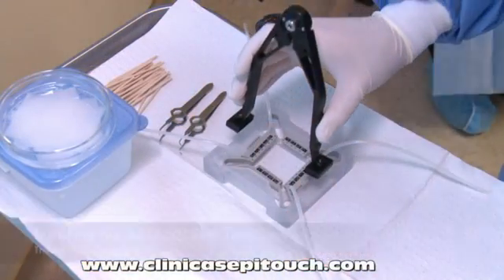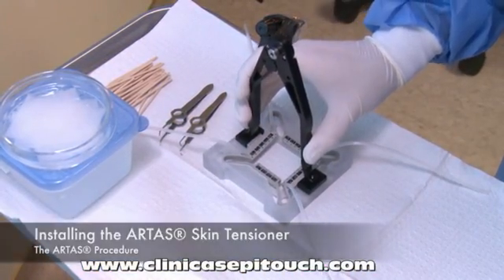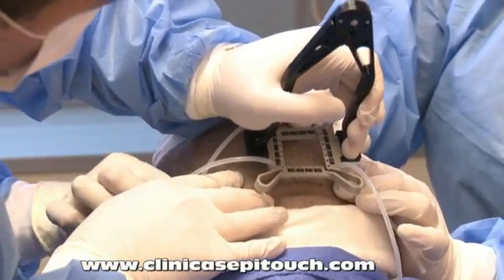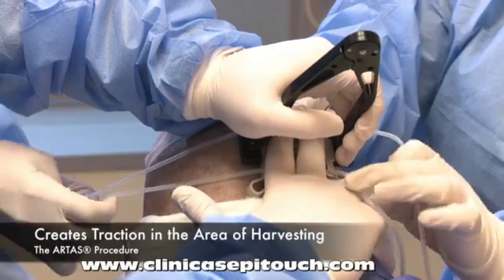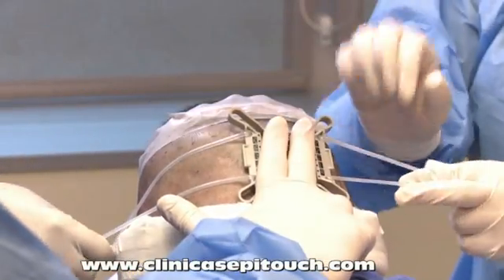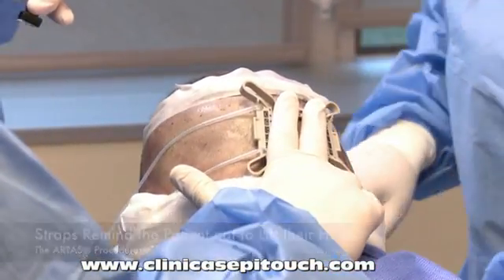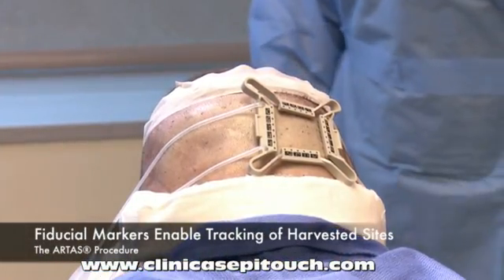With the patient seated comfortably, the ARTAS skin tensioner will be installed onto the patient's donor area. The ARTAS skin tensioner is designed to create traction in the area of harvesting. The straps provide the patient with a friendly reminder not to lift their head, and the fiducial markers enable tracking of harvested sites.